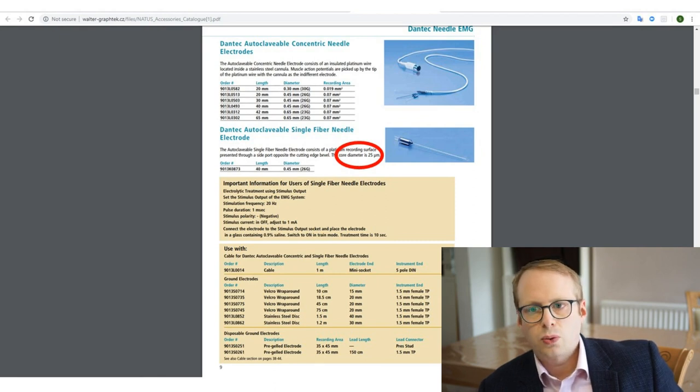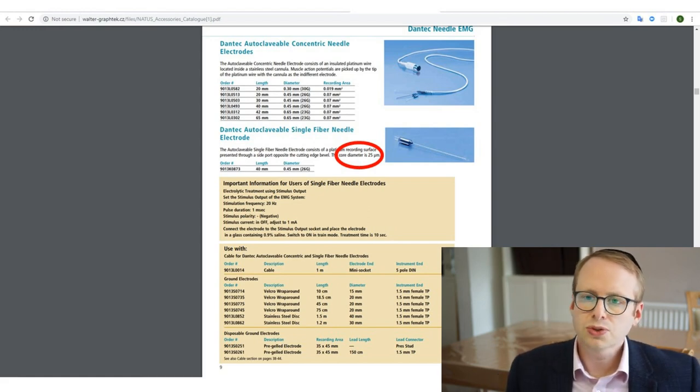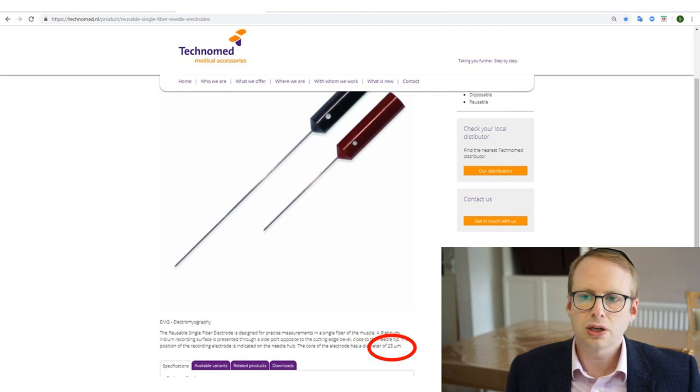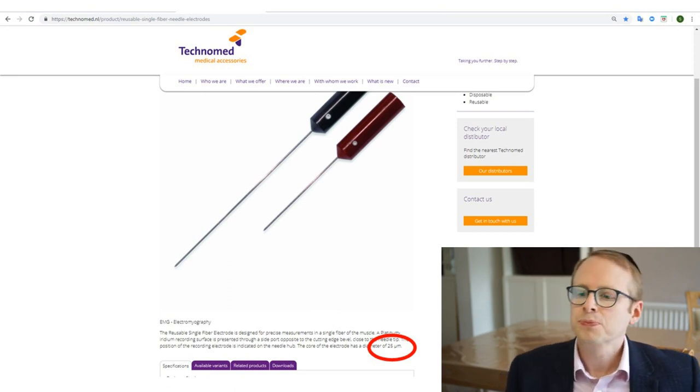Let's compare that with a couple of reusable EMG needles. From Dantec, they've got their autoclavable single fibre EMG needle electrode of 25 micrometre diameter — and that's exactly the same as what's published in the Stahlberg books. Technomed similarly also do a reusable one with a diameter of 25 micrometres in terms of its inner core. Of course, the inner core is very different to the outer sheath of the needle, and I'll just draw your attention to that very important point.